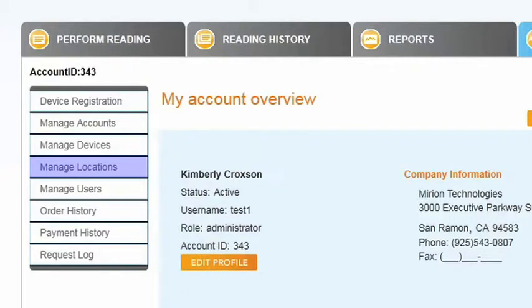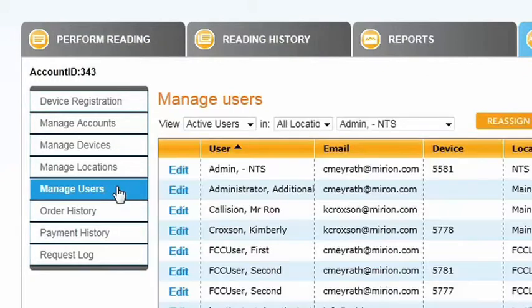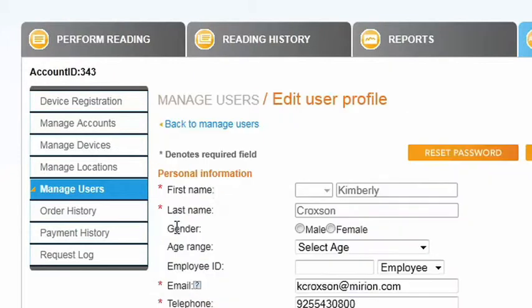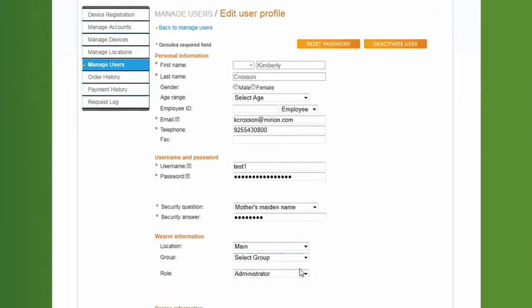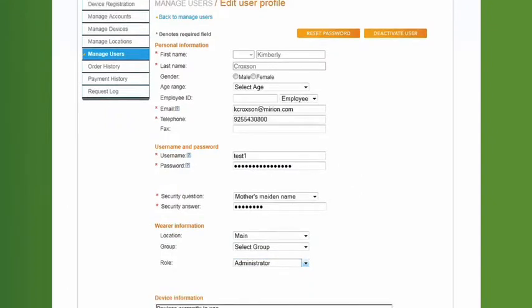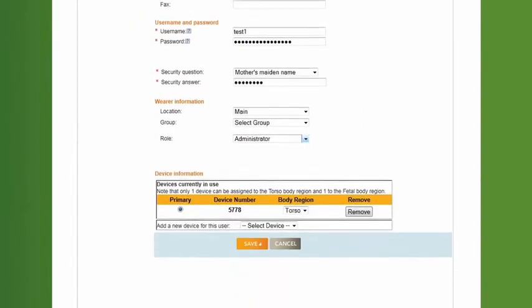Under Locations, you can add and modify locations. Under Users, you can add and modify wearers. From the Manage Users section of AMP, you can edit current users, add new users, and reassign devices.